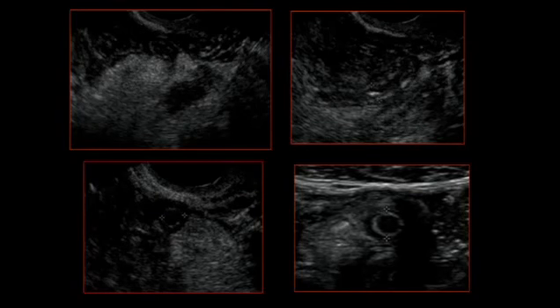Here's another patient with pelvic appendicitis on a transvaginal examination. As I've stated before, every female patient in whom the appendix is not seen from a transabdominal approach must have a transvaginal examination. We see beautiful inflamed echogenic fat. This tells us where the problem is and that this is an inflammatory condition. It's echogenic, mass-like, non-compressible. It's very tender to probe pressure, and when we look very carefully in this location, we find embedded in the fat a very rounded structure in contrast to the ovoid appendix I showed you before, measuring more than 6 millimeters, and this is pelvic appendicitis.